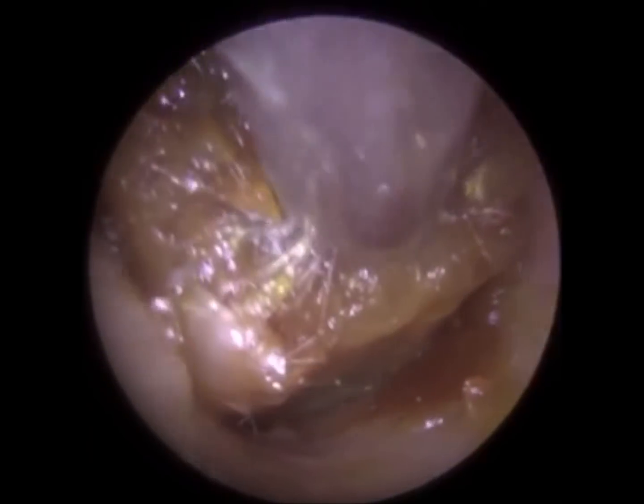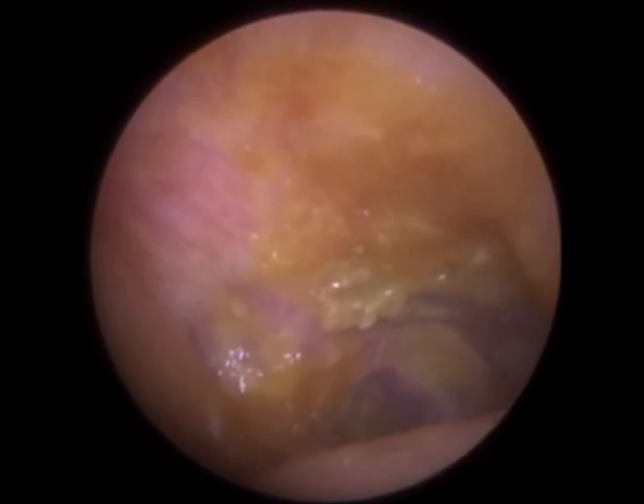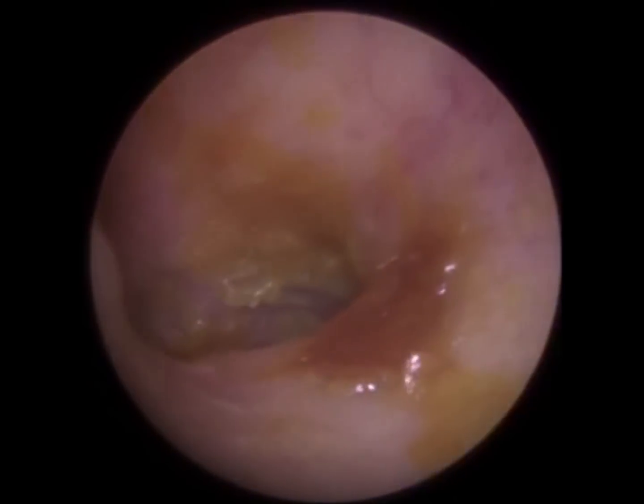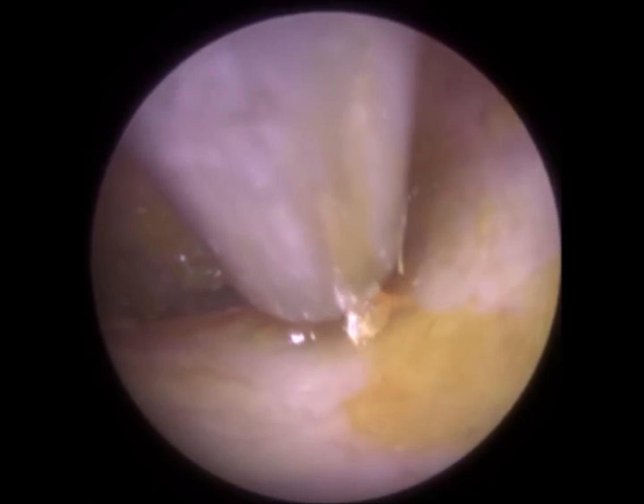Just bringing that forwards. There we are. I've got the big plug of wax out. It's instant relief for the patient. It's a bit of dead keratin there. So the eardrum, the symptoms were alleviated, but you can see it's a bit of mushy dead wax with some keratin. So I've just gone back in with the Zollner suction probe, just trying to see if I can mop it up.